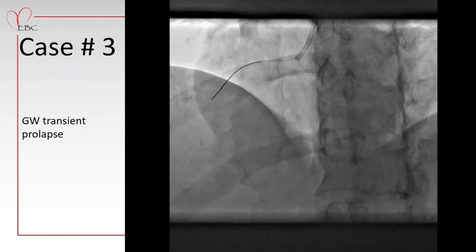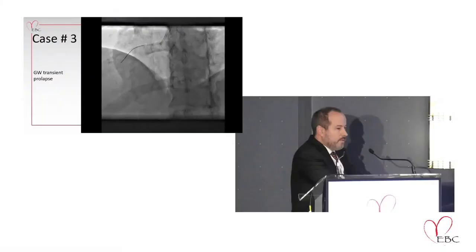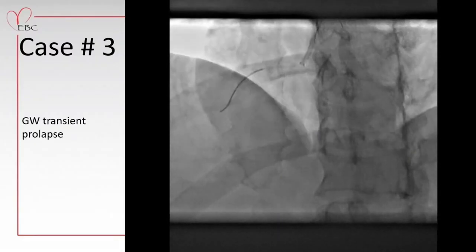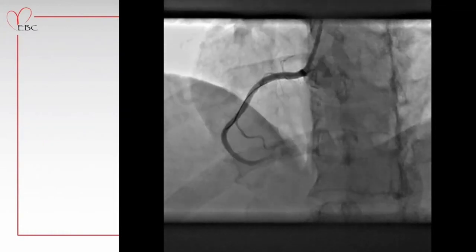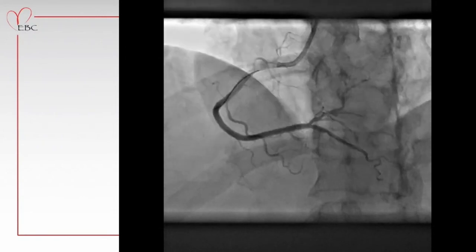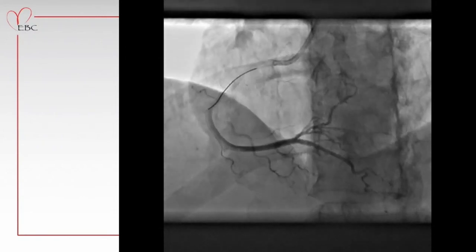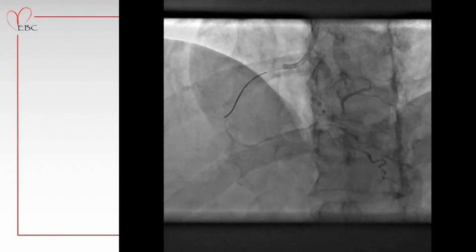This is a case where we have a transient prolapse of the floating guide wire into the artery. As you can see, the floating wire temporarily entered the artery; however, this had no complications, and the final result is great.